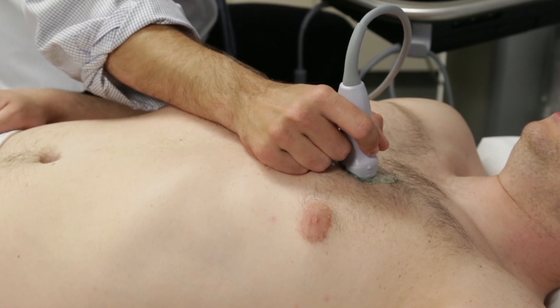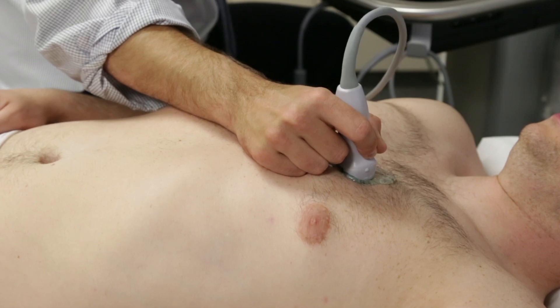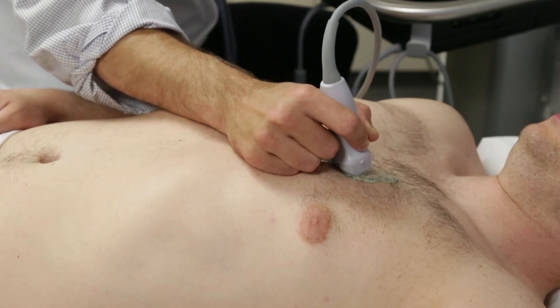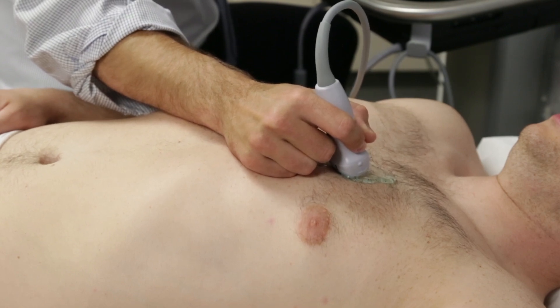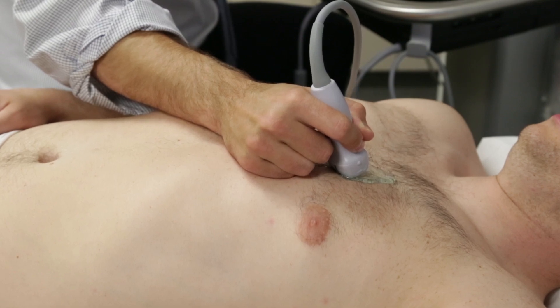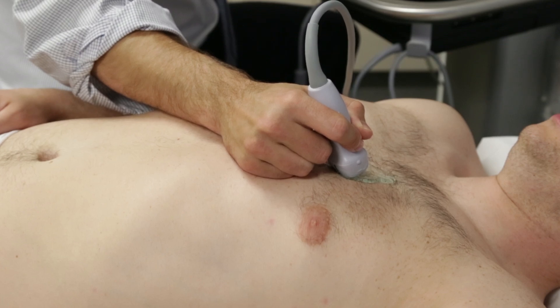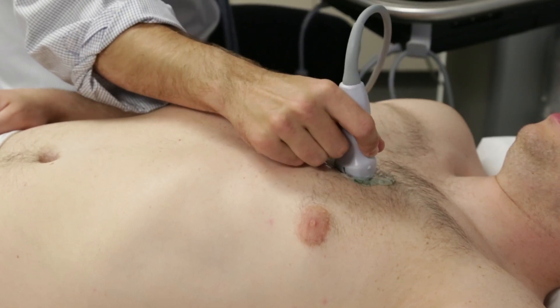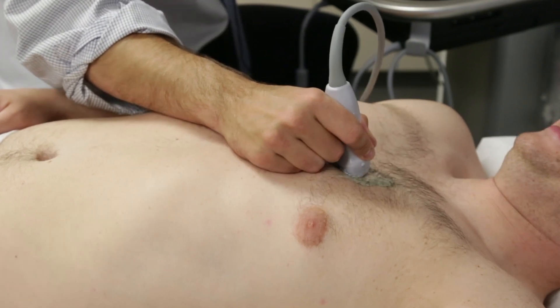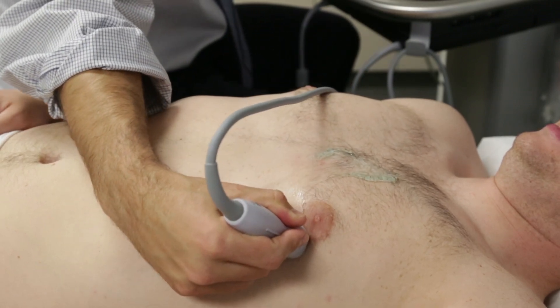Now we will move from the parasternal short axis view to the apical four-chamber view. This can be challenging due to repositioning of the probe on the patient's chest and due to the often substantial difference in probe positioning required from patient to patient. It is often necessary to place the patient in some degree of leftward rotation, if not fully in the left lateral decubitus position. The probe marker should remain towards the three o'clock position, and the probe is moved inferiorly and laterally to the left nipple.